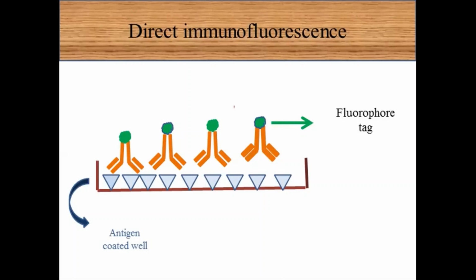Once you know the value of the intensity of the fluorescence, you can easily determine the concentration of the antigen. How can we determine the intensity of fluorescence? By the spectrophotometry method, we put the test tubes in it. It shows the value of the intensity of the fluorescence. The value is noted.